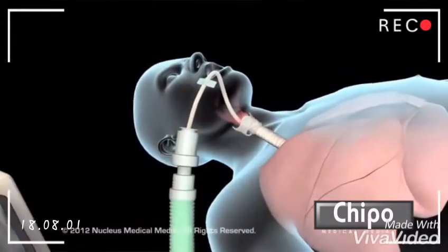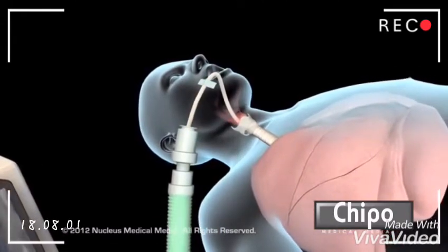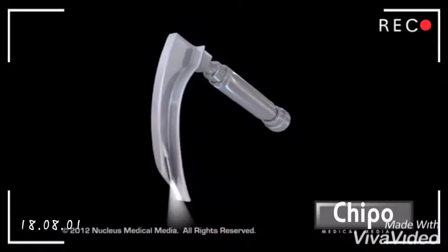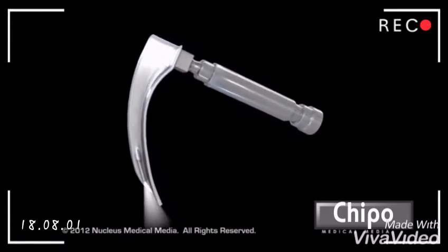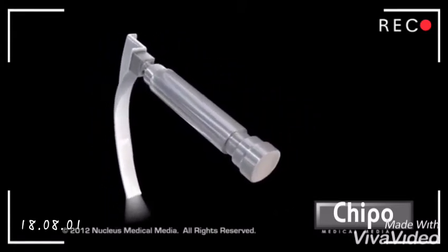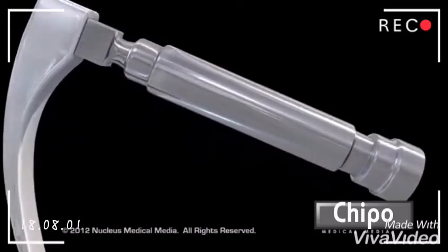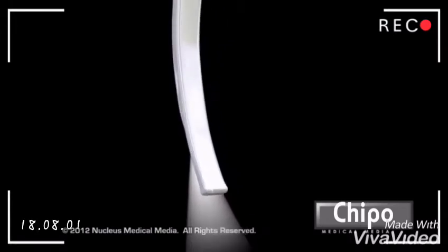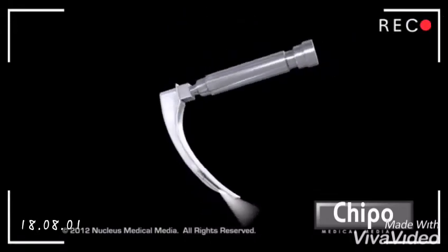Mechanical ventilation is also used during surgical procedures. The first step in mechanical ventilation is called endotracheal intubation. During this procedure, an instrument called a laryngoscope is used. To perform the intubation, a laryngoscope, which consists of a handle, light, and dull blade, helps guide the endotracheal tube to its proper position.